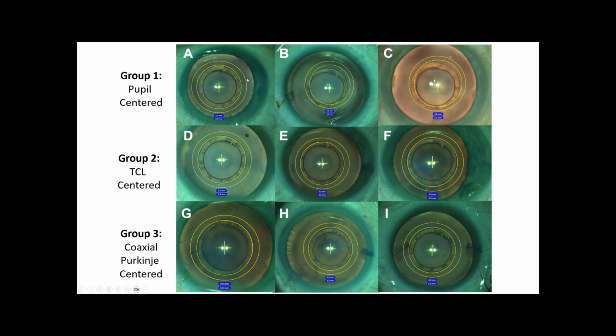A way of thinking about these two sizes is that the 6 millimeter represents the optic body and the 5 millimeter represents where ideally the capsulotomy would be located. And we can see for the pupil-centered group, we do achieve some nice centration, absolutely, in some eyes. But in the majority of eyes, we see decentration, and actually quite major decentration here. This is what we were seeing in the other images, that when the IOL is there, 6 millimeter optic body, the capsulotomy can be very close to the edge.